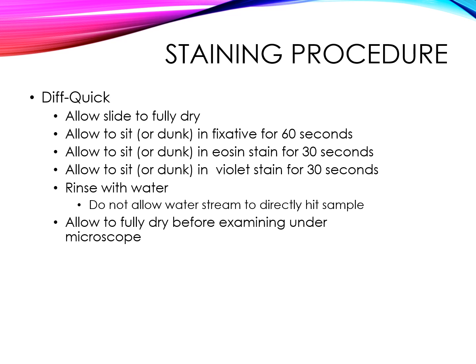Personally, I find that 10 dunks in the fixative, blot off, 10 dunks in the red, blot off, and 8 in the purple, blot off works best for me. I just find that the blue stain is a little heavier, and you just need a little bit less.